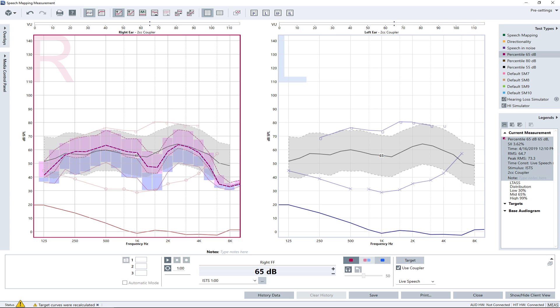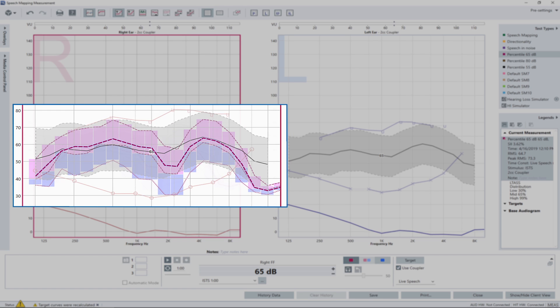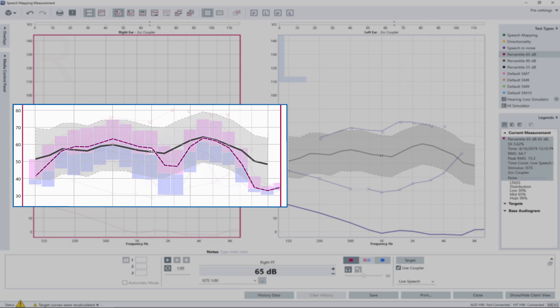After the measurement is completed, the results of the percentile analysis are displayed on your screen and can be compared to the fitting target. The LTAS line should match the black target line, and the area covered with the percentile bars should roughly match the gray speechogram area. In our example, this is not yet the case.